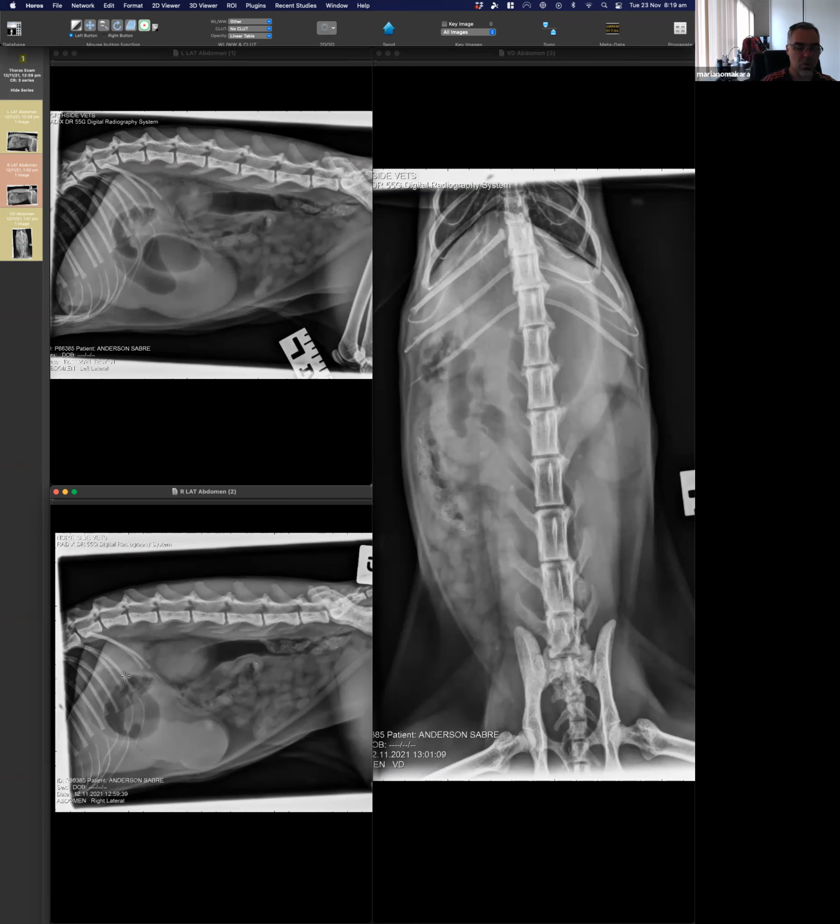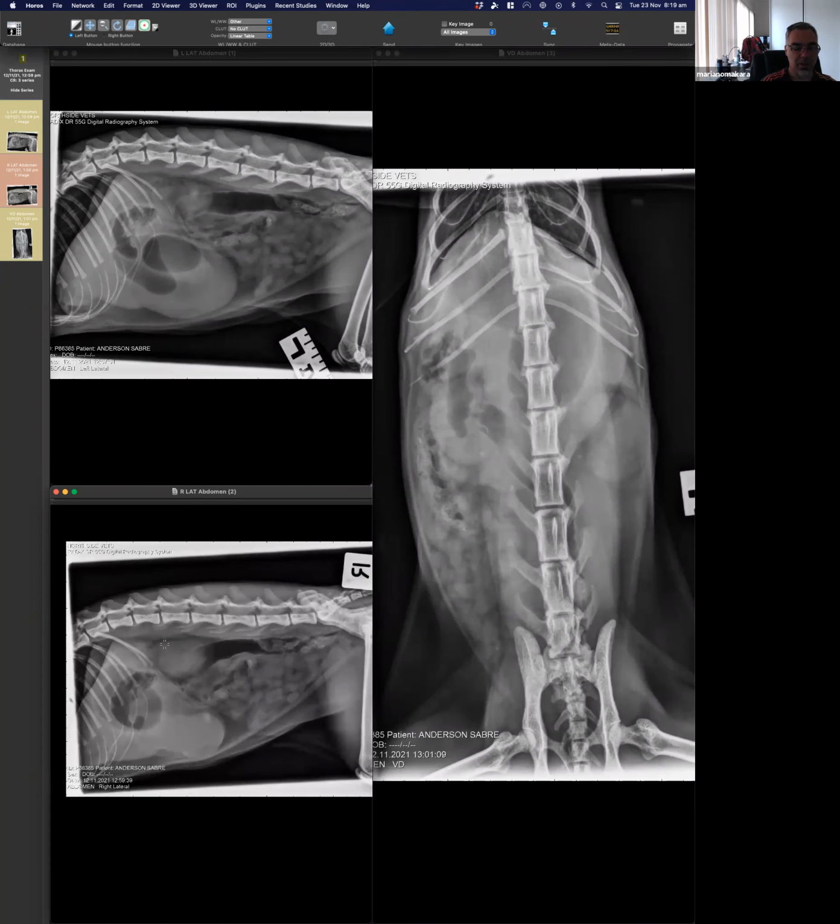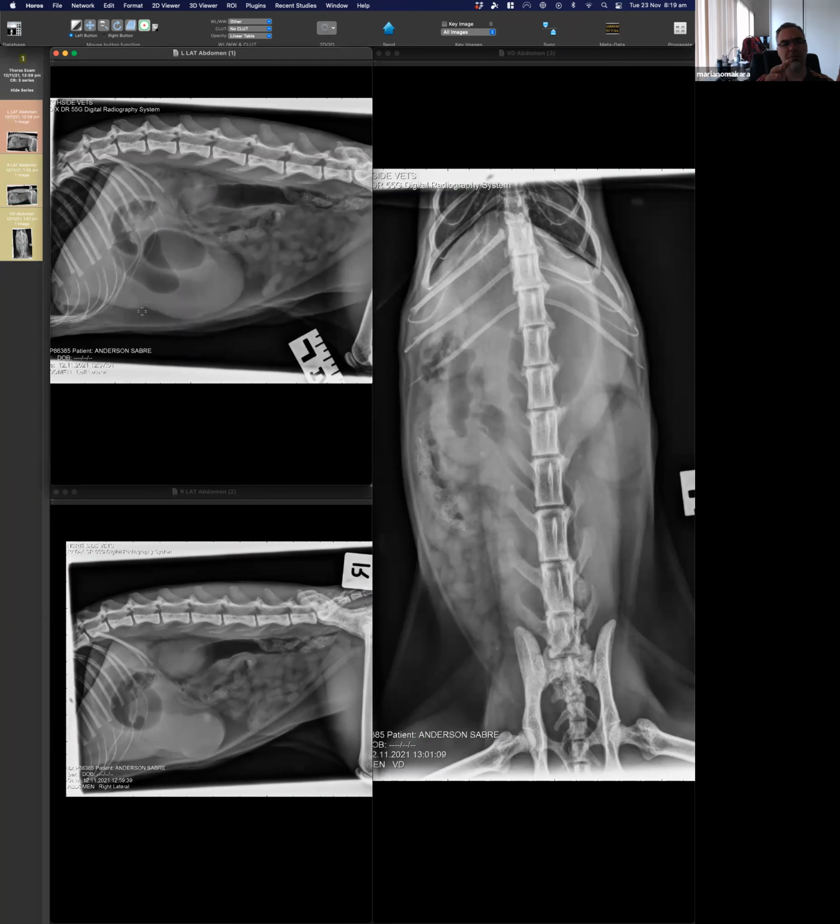So now we're in a right lateral projection. The left is up. There is gas in the left. So the stomach goes up to there, and sometimes it goes even more. And I wonder if it's going more, but because of fluid and gas, the gas is sitting on top. So actually, the stomach goes all the way up to here, and then this is the body, and then this is the right part. It's a small detail, but it's just to clarify where it sits anatomically. And I think the more we look at images, the more certain we are about where things should be, and then we rely on very small changes. So that's why I'm stressing that.